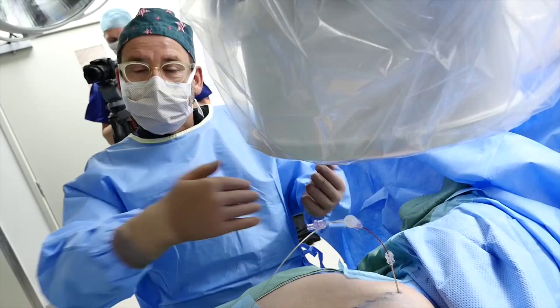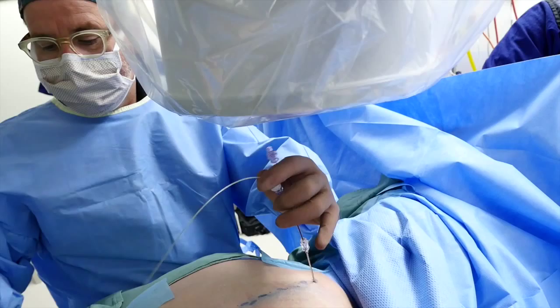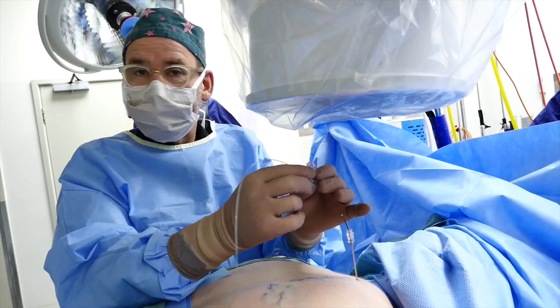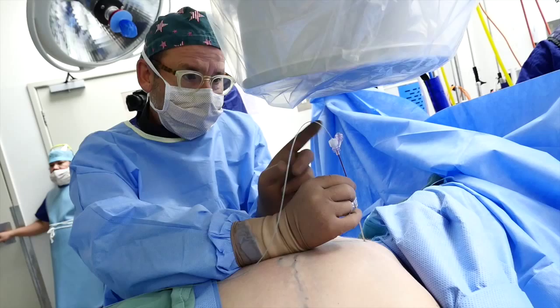I'm going to advance the sheath a little and rotate my needle a little. Looking down here with the stylet, I'm going to pull that back about two to three inches. I've got a choice of feeding this lead up with the sheath — I'm going to lock that back down and push a little on the sheath. Watch that screen. I push the sheath going up — it's looking beautiful. If I want that to just tuck up a little more, that's more than enough. Perfect.